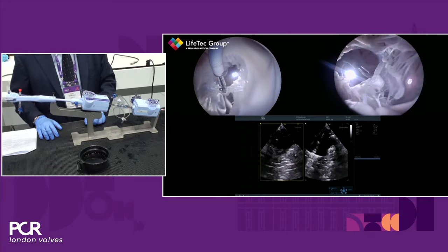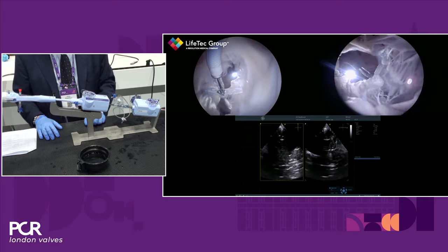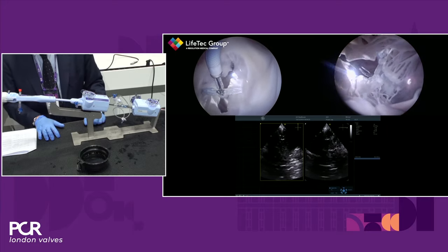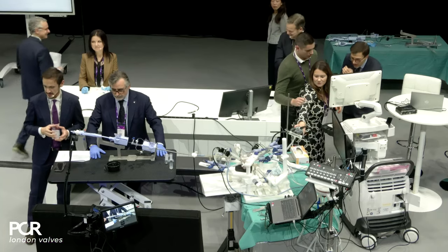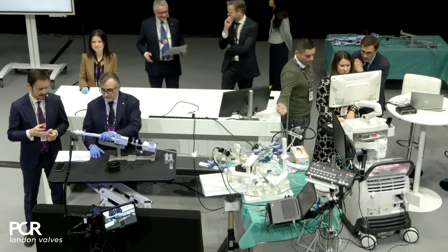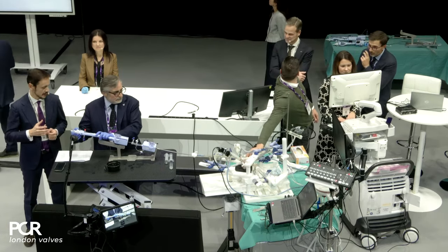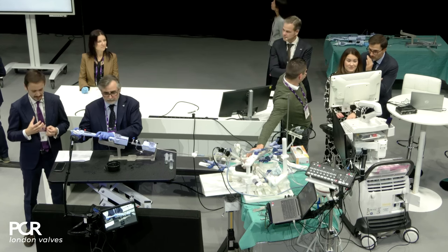Let's say that now the clip is already above the chordal-free zone in the anteroseptal portion of the valve, which would be the target in this specific patient. But obviously, we need to get there with the clip first. Having the TriClip dedicated delivery system allows us to go there in a straightforward way with good trajectory and really minimal manipulation. So the procedure is extremely safe.